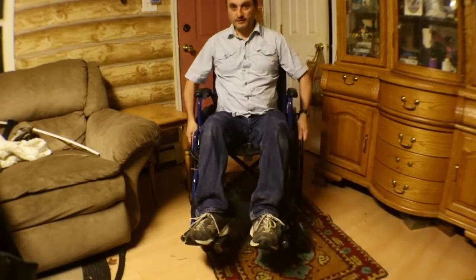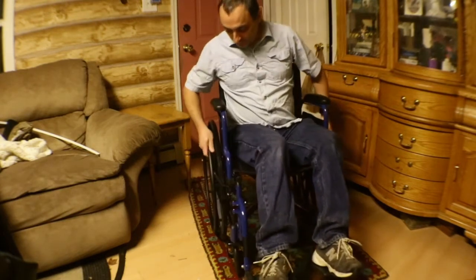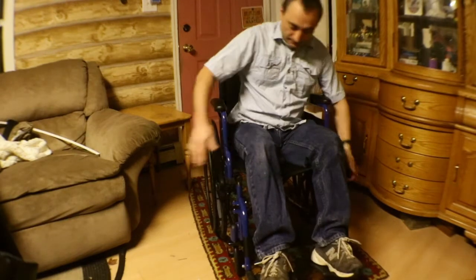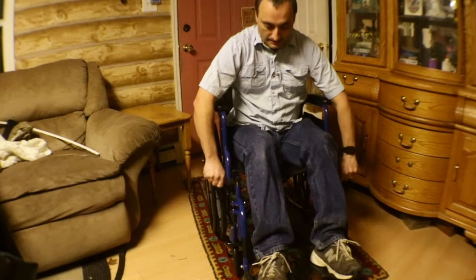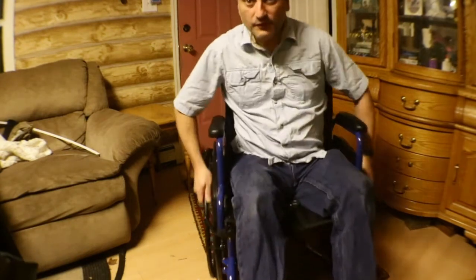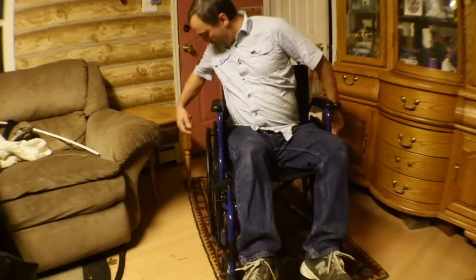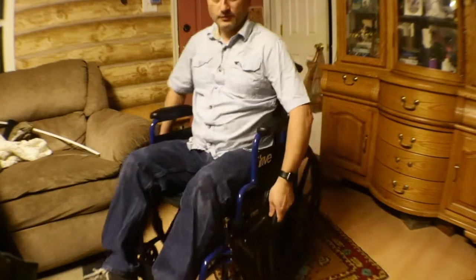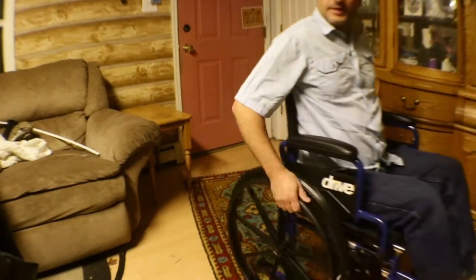It's nothing fancy, but for like $110 let's see how it does. The brakes are tough but they work — it doesn't move, which is good. I think it's gonna work out. This is gonna be great for my mom to be able to be out longer and not get as tired out.